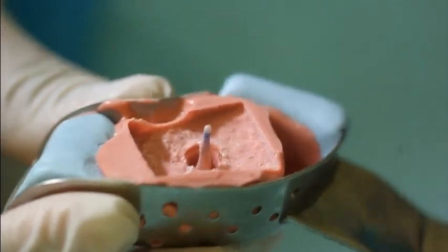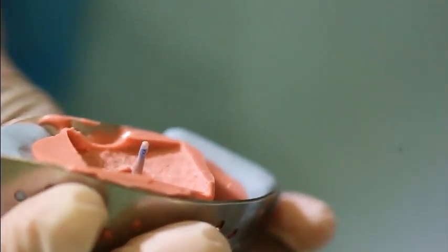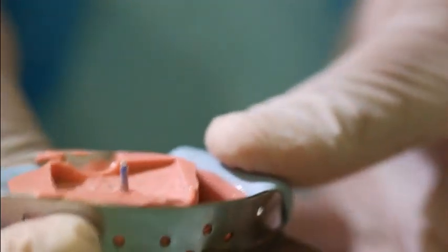Alright, once the material is completely set, you can remove it.